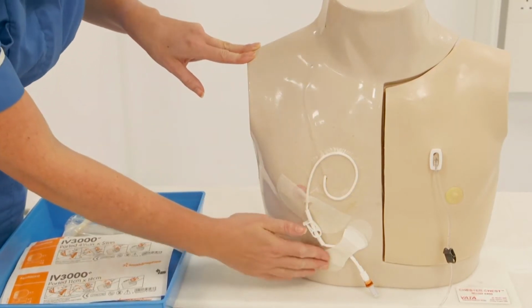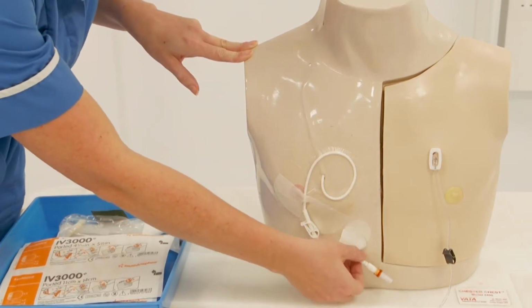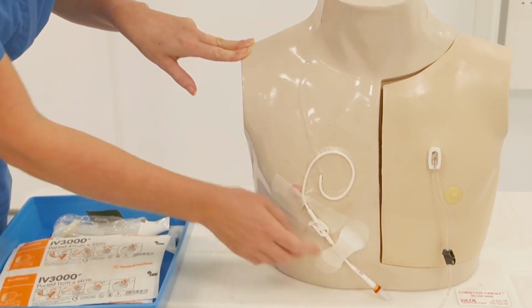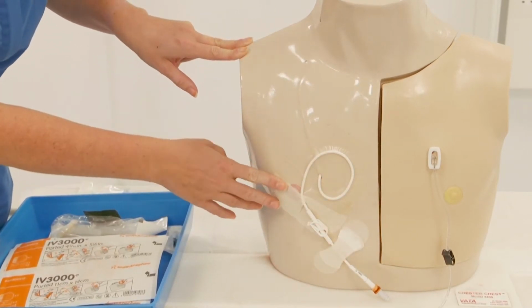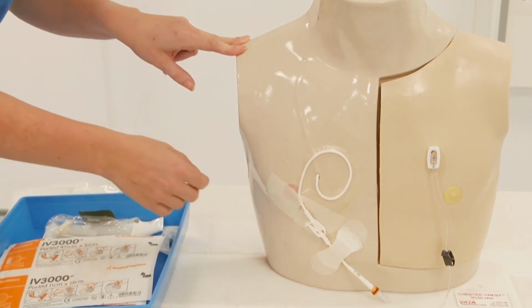Other things we use include these strips here. This is also to make sure that, again, if the line is pulled, then it pulls the dressing across of it and the top dressing to stop that line from being pulled out. Both of these should be in place at all times where possible.